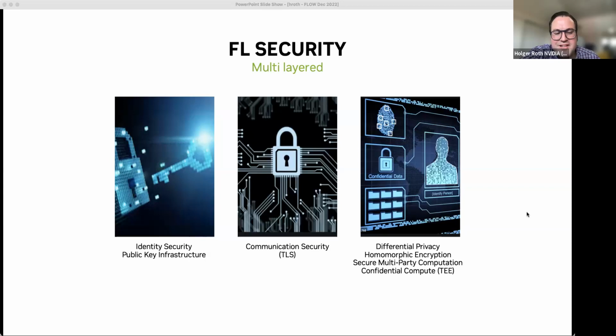But as far as I understand, there are actually a lot of people looking into how these protocols maybe need to be updated in order to account for the recent developments in artificial intelligence and machine learning, and how you can do online monitoring of models to ensure that they maybe can even be adapted to new data coming in, but don't lose their performance and things like that, right? So these are all relatively open questions at the moment, I think. As far as I know, the FDA is kind of changing their policies as we speak, basically. So this is a room to be observed for new regulatory guidelines.